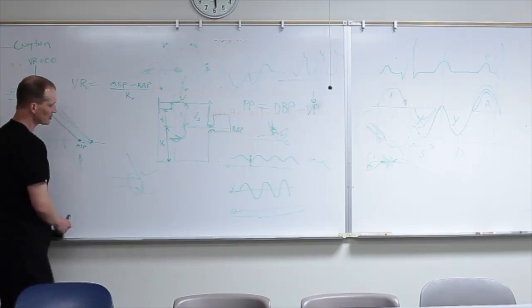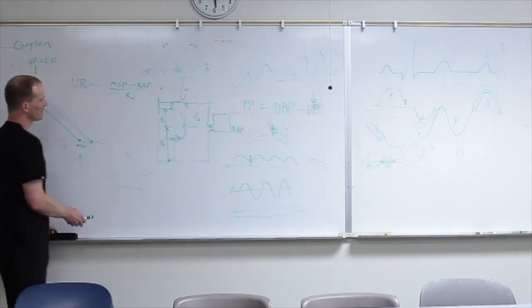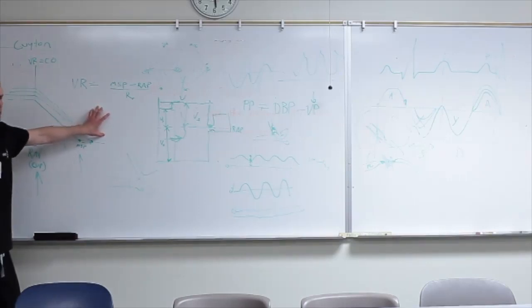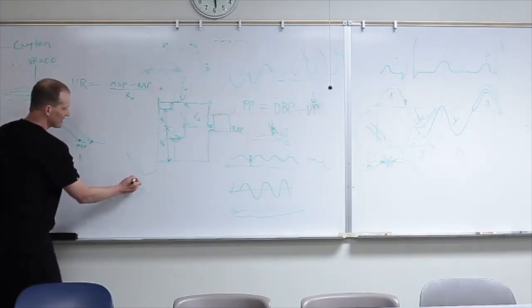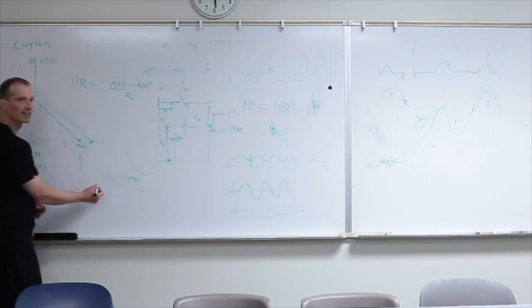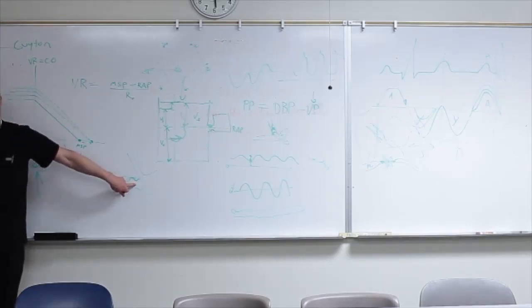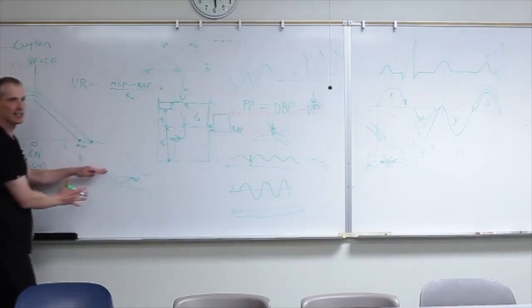So we maybe should not be doing these collapsibility indexes, which we're doing, and I think we'll still do it. But if you see the IVC and it's not really collapsing much here with respiration, but everywhere else it is, then this is probably not telling you the real story, okay? You've got to look at the whole IVC.